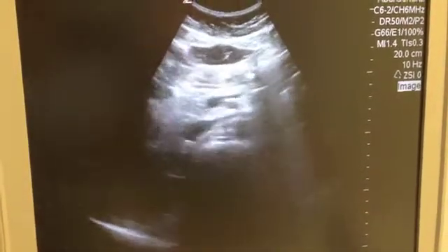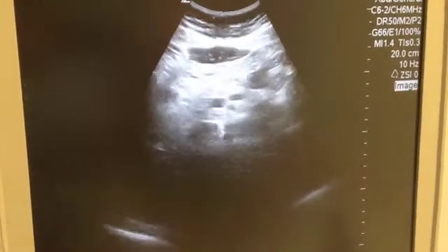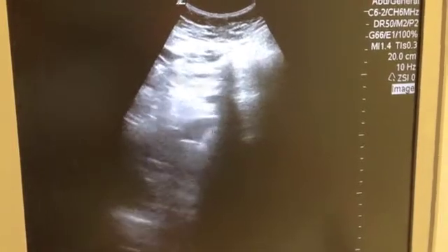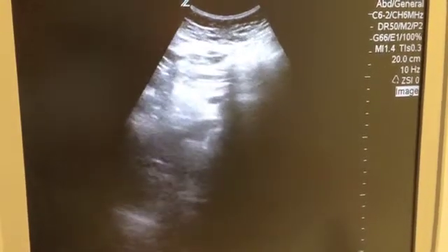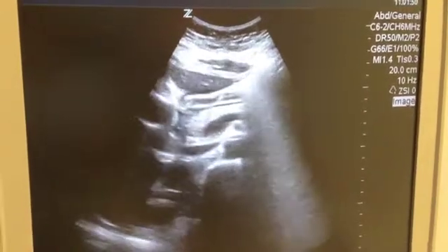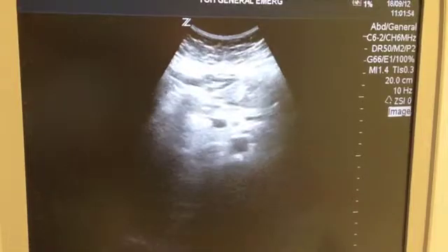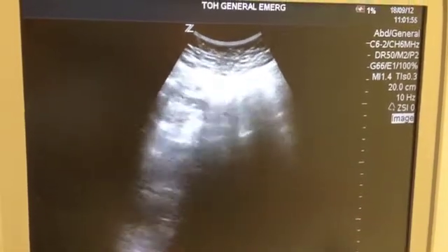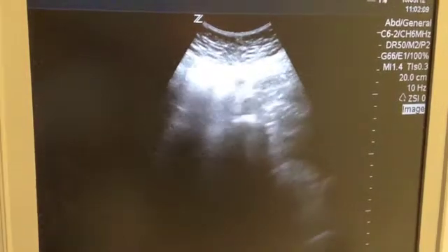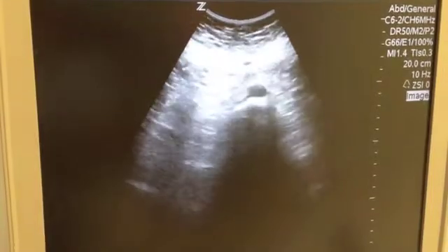Sometimes when you're scanning the aorta, you'll run into an area of gas. If you're in the proximal aorta, you can ask the patient to take a big breath in — the gas will move towards her feet. Then you keep scanning, and if you run into the same patch of gas again, ask the patient to breathe out, and the aorta will reappear so you can finish your scan.